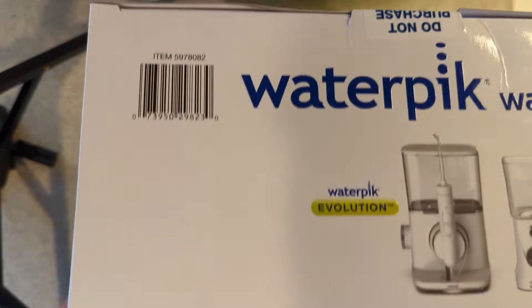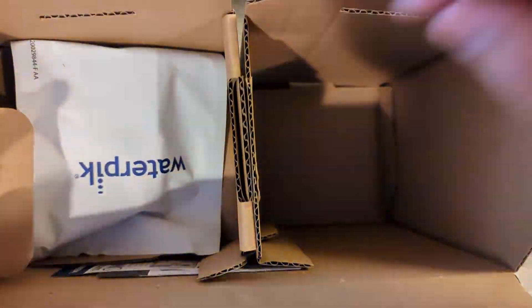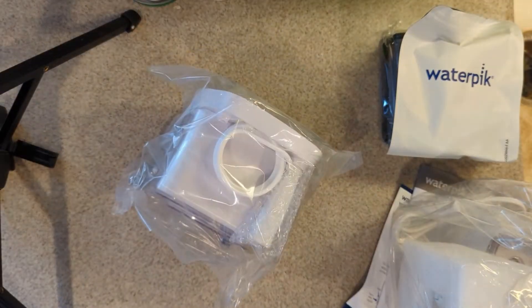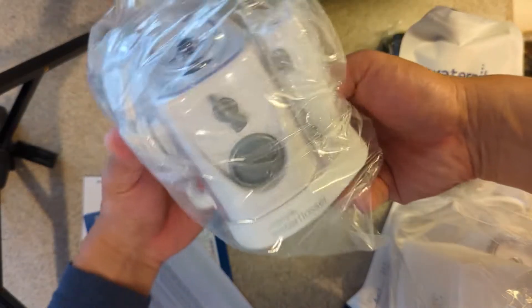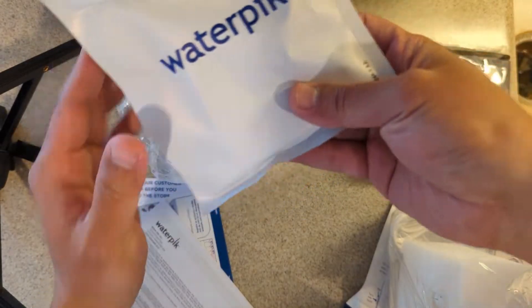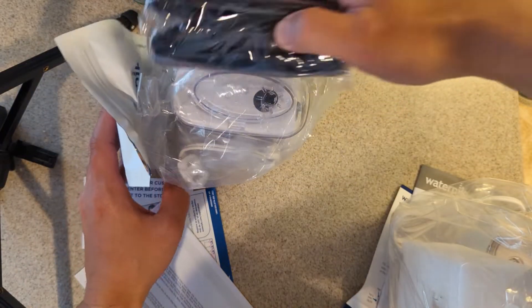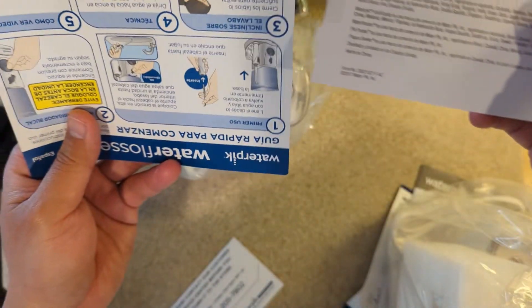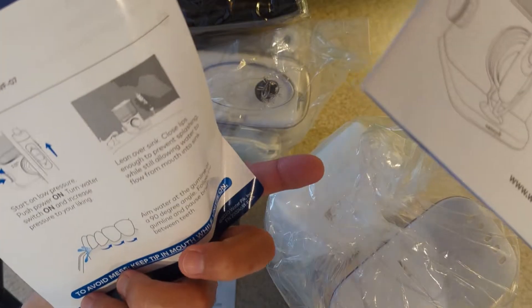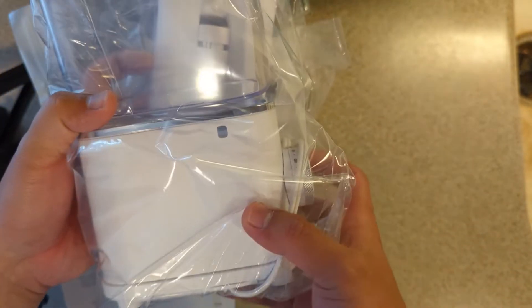Let's open it up and see how it looks inside. This is the smaller one for traveling, it looks like this. These are probably the tips, and there's a bag for this smaller travel kit. There's some users manual, and this is the main machine — the larger one.